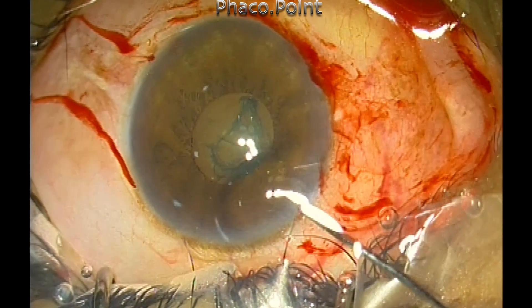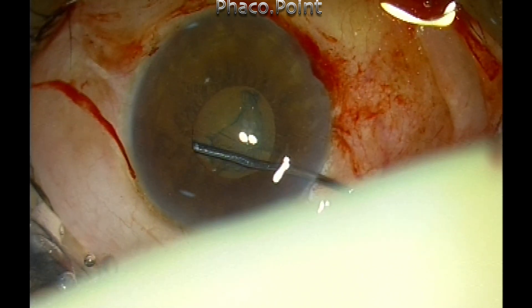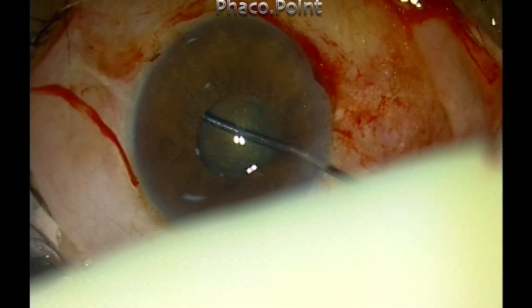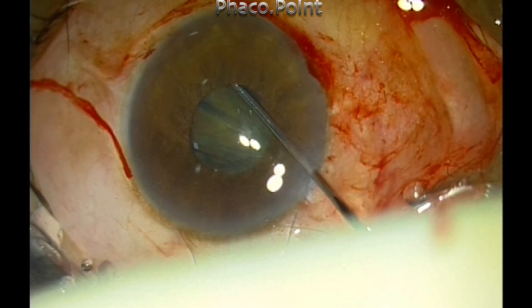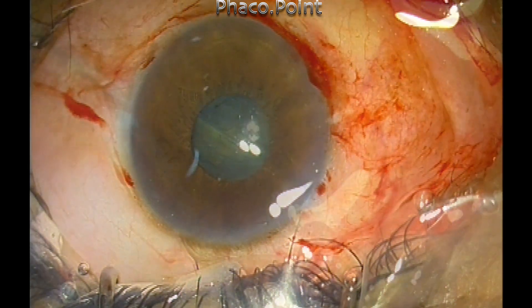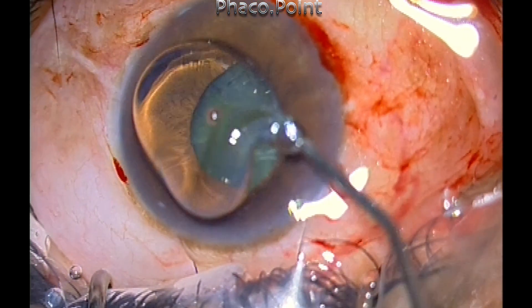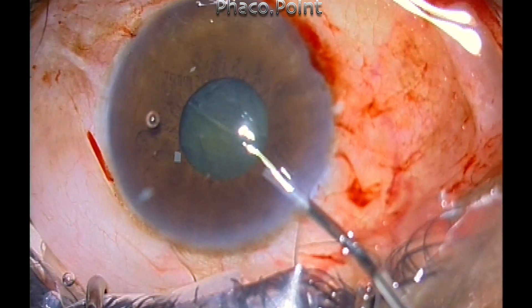Cortical cleavage hydrodissection is extremely important because this nucleus needs to rotate. Now let's move on to the phacoemulsification part, and this is totally unedited.